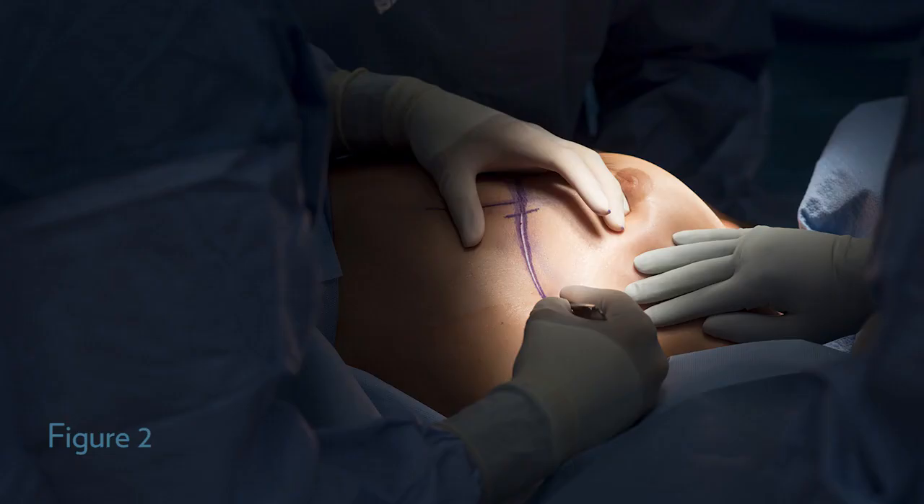In figure two I am starting to incise along the inframammary lateral line. You can see the hash marks there, and I usually draw out about an eight centimeter incision so that I can fit the majority of my hand in to aid in the dissection. This line is right along the inframammary crease and I try to place it a little bit lateral so that it will have a better cosmetic appearance and allows me better access to the axilla in case of doing a lymph node procedure at the same time.